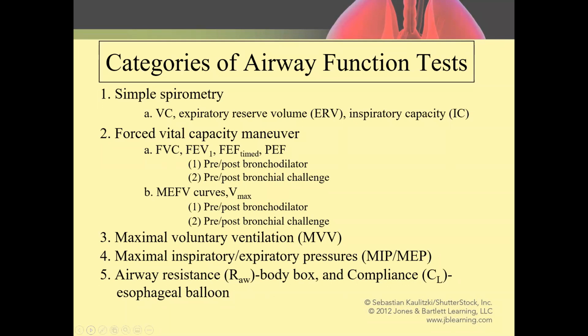So there's a host of bedside spirometers available out there. They're digital technology that can be interfaced with a computer in order to print out things like flow volume loops and things along those lines. Some of those depictions I actually have in this presentation. And then we'll look at pre and post bronchodilator figures as well. We'll talk a little bit about bronchial provocation or bronchial challenge through the use of methacholine. So we'll talk a little bit about that as well.